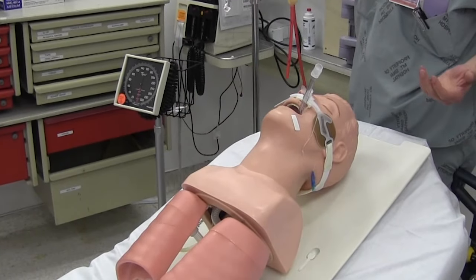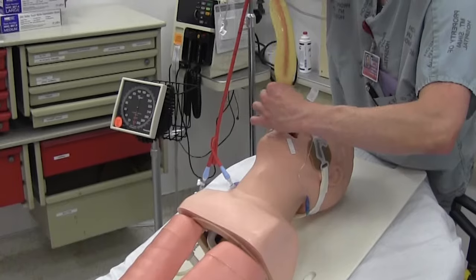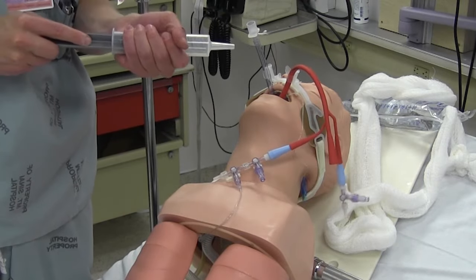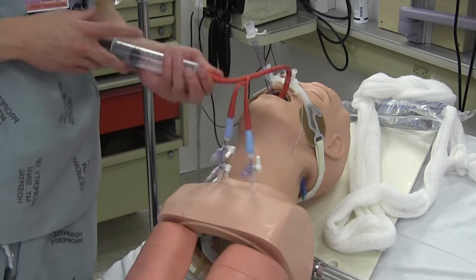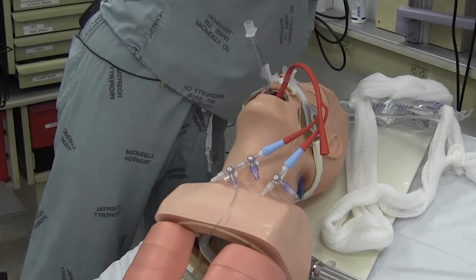This just goes in like an NG tube. If you have any problems, use a laryngoscope to help you get that stuff out of the way. Insert until you get to 50 centimeters at the lips, and make sure the markings are facing the patient's right — that orients the balloon properly. Once you think you have it in, get your slip syringe and insufflate through the gastric lavage port while someone auscultates over the stomach, then auscultate over the lungs and make sure it's in the stomach. Sometimes they'll hook up end-tidal CO2 temporarily to confirm there's no CO2 return — this tells you at the very least it's not in the lungs.